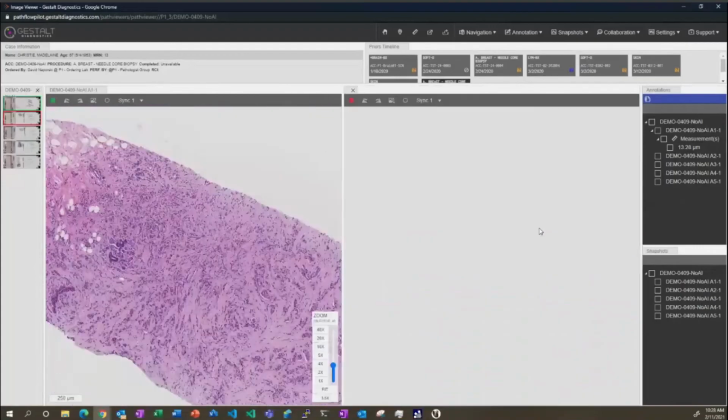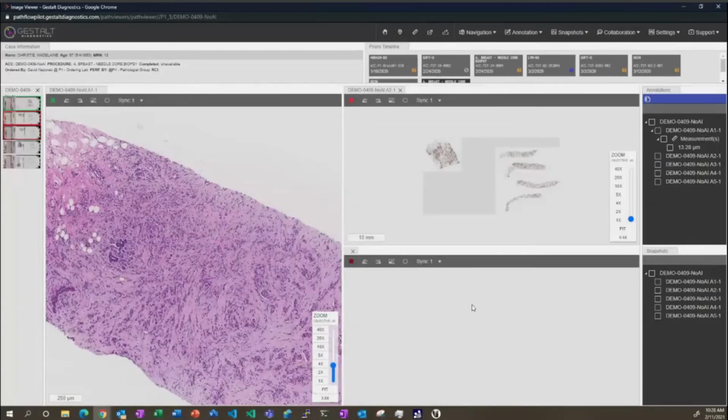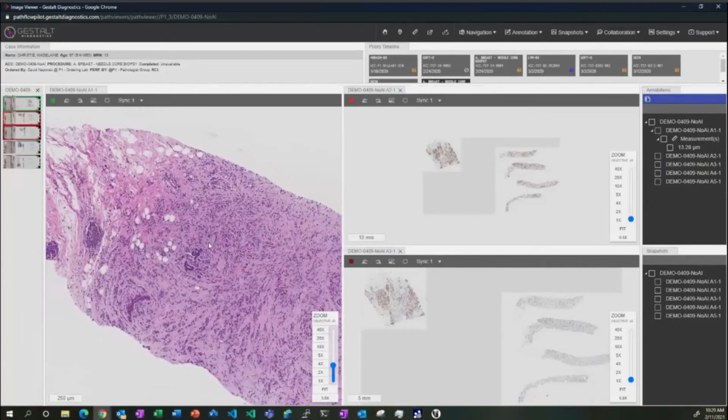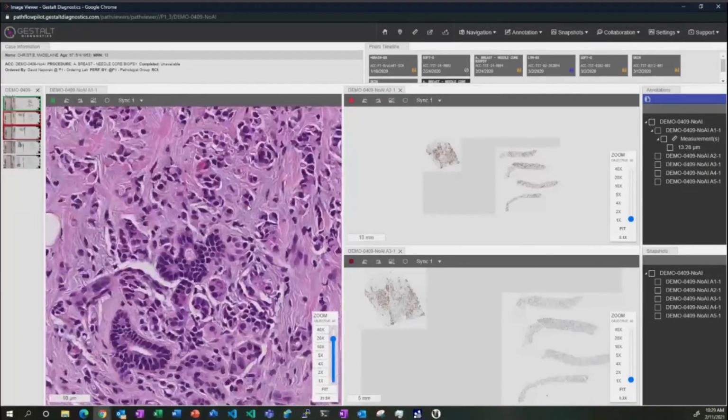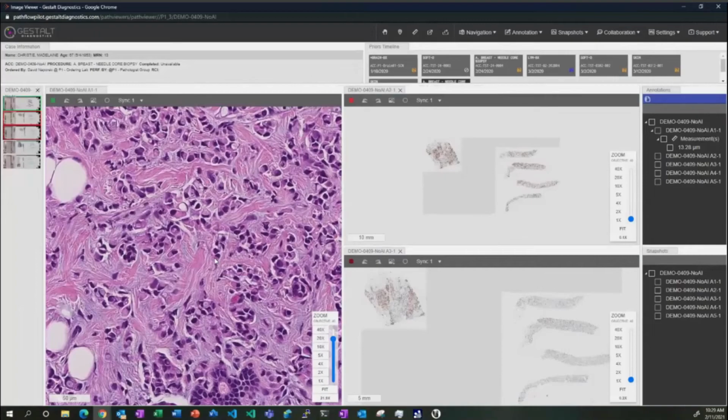And we have the H&E stain here, and then this is a PR, which is a progesterone receptor staining, and then there's an estrogen receptor staining. And so the pathologist has already looked at the coloration of these other biomarkers, the ER and PR, and is able to identify the region of highest activity, or at least be guided towards it.